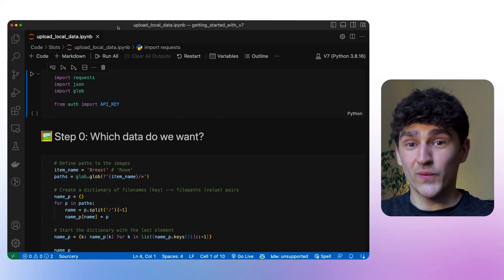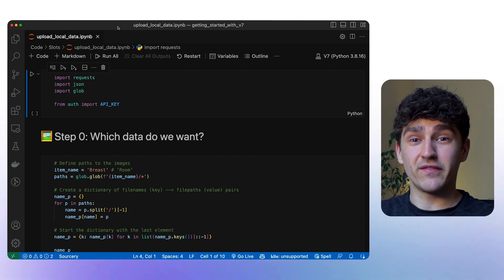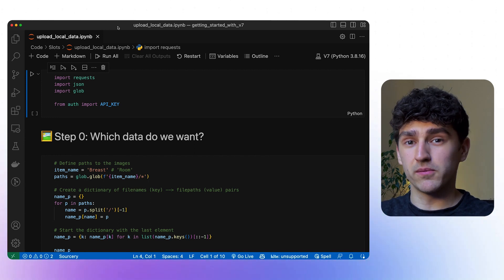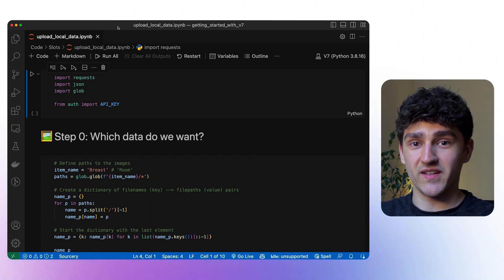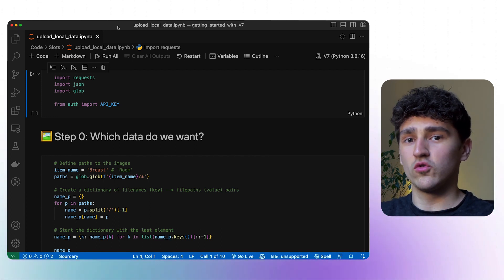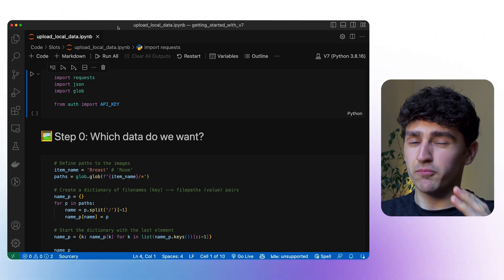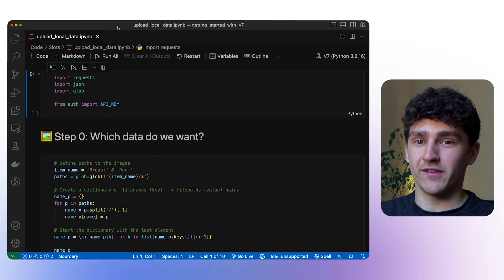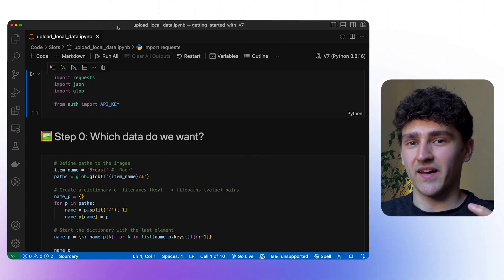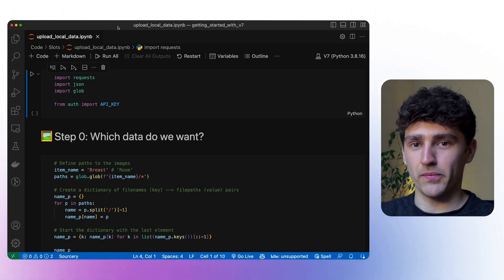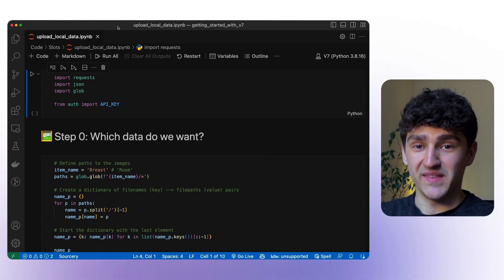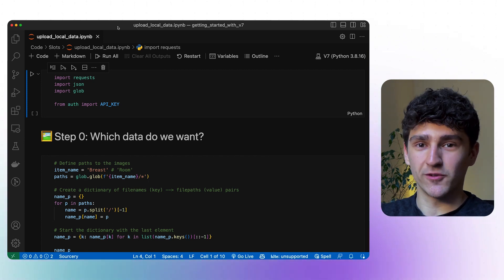Let's look at how to actually upload data into specific slots using the REST API. We already have a full video on uploading and registering data to V7, so we won't go into too much detail here. It's pretty much exactly the same — we just have to modify a tiny bit of the payload that we are sending. Let's look at the code.